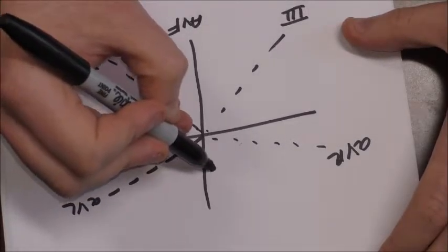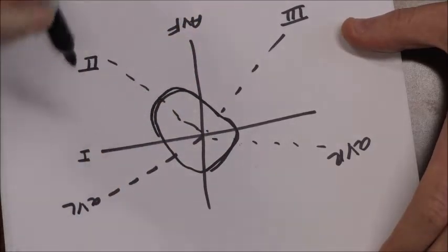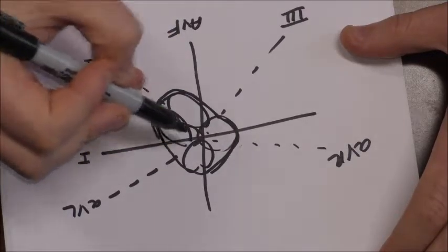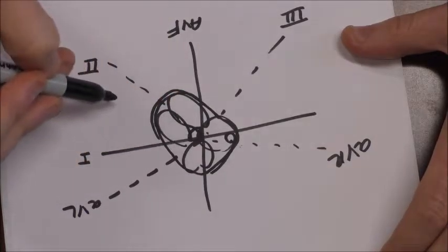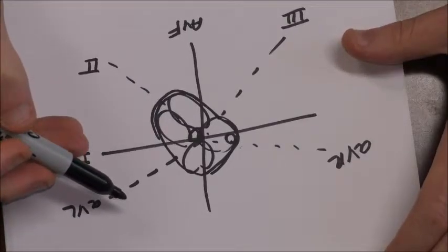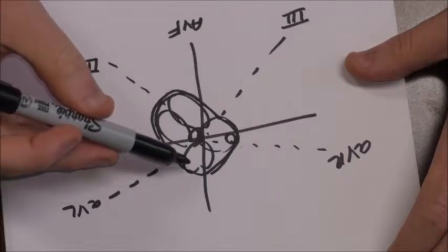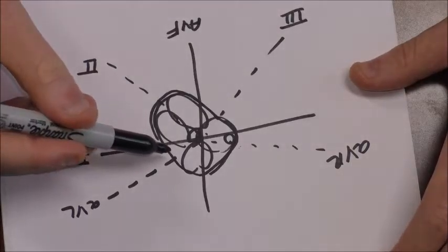And so if we do that, then we know that the heart kind of sits in an orientation like this. And if we go back to our normal anatomy and we look at our atria and our ventricles, then we know that the heart is depolarizing somewhere in the direction towards lead 2. It's important again to remember that when cells are depolarizing, you have charge that's emitted from them that's actually going in all directions, but what we're reading on EKG is the mean of the vectors.